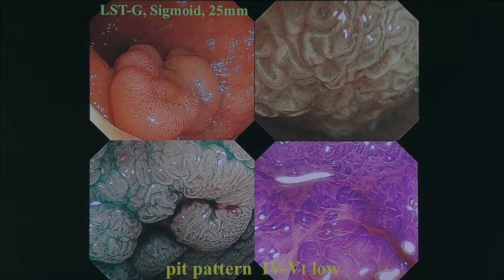I didn't think the lesion was deeply invasive, so I decided to perform EMR.